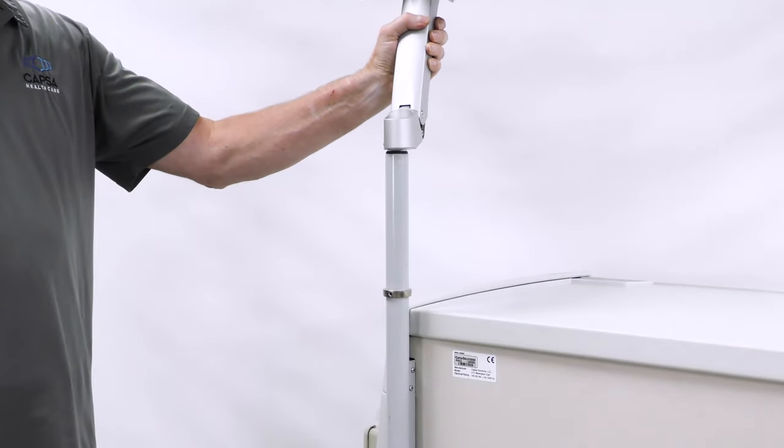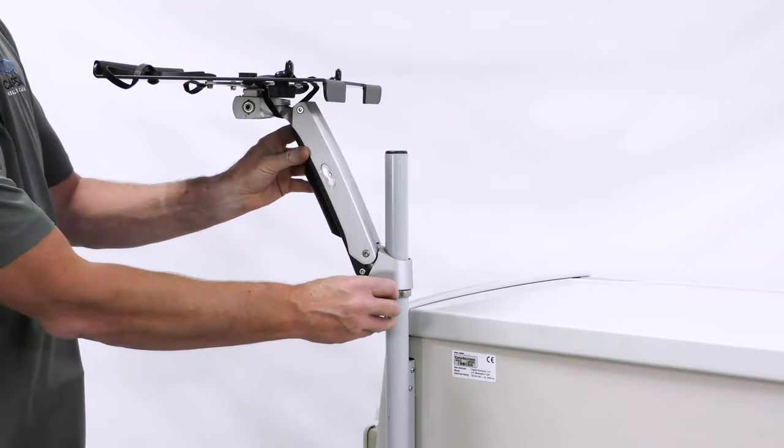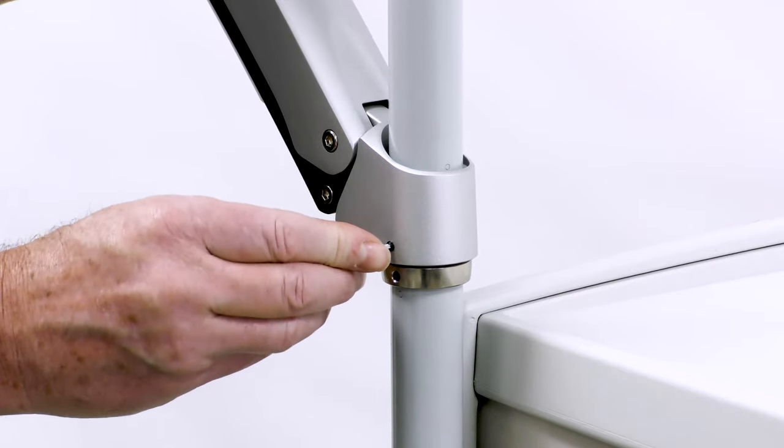Slide the AX arm onto the post to the silver base collar. Use the supplied allen wrench to snug the tension screw.